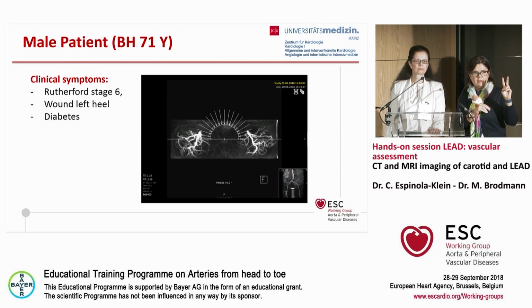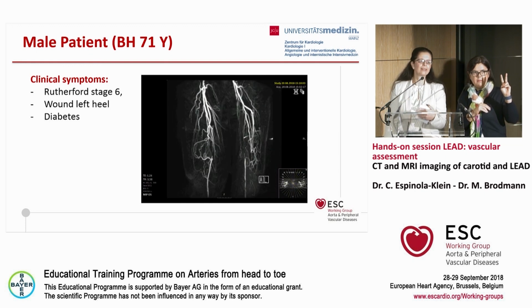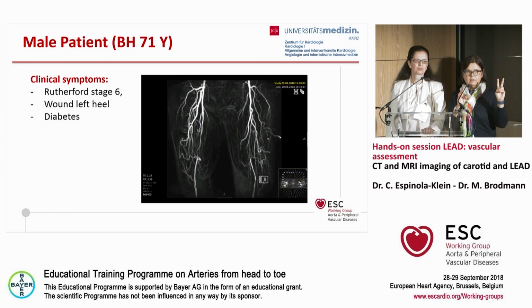Duplex ultrasound only. MRI. We have it already in this case, of course. CTA.